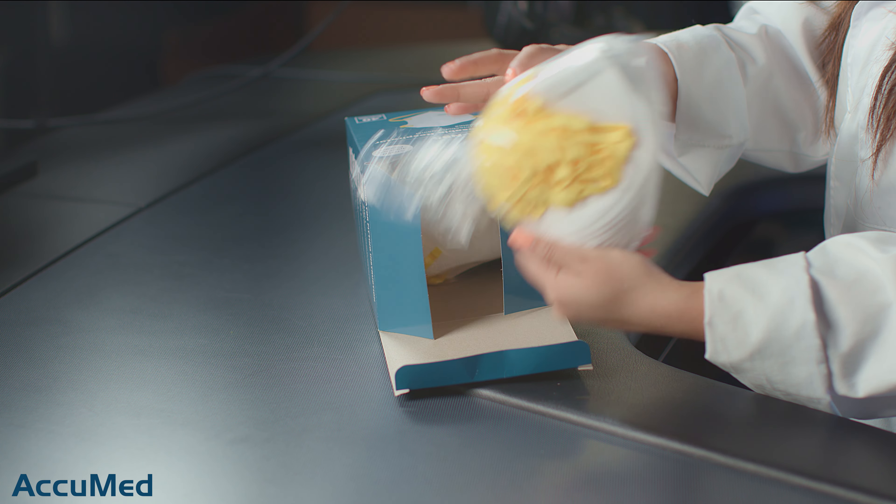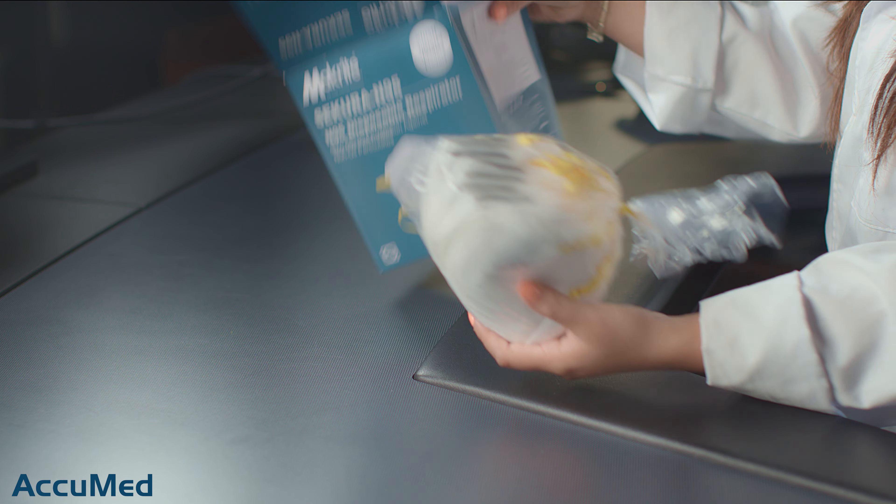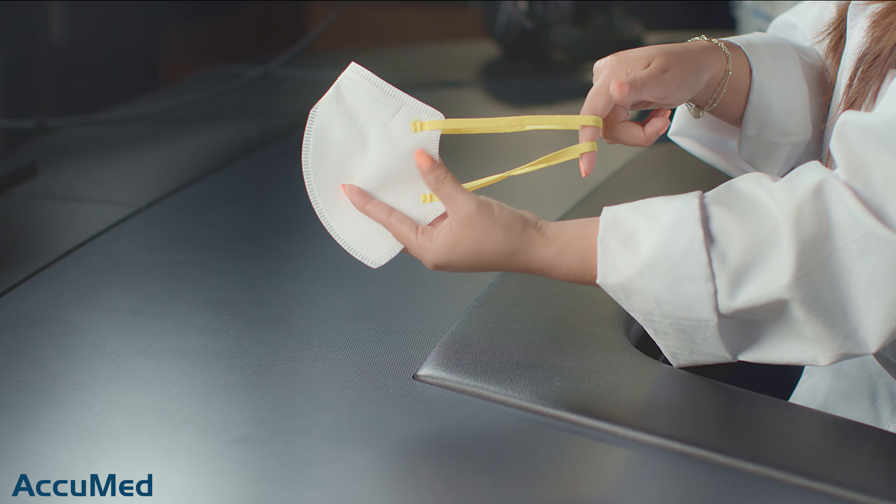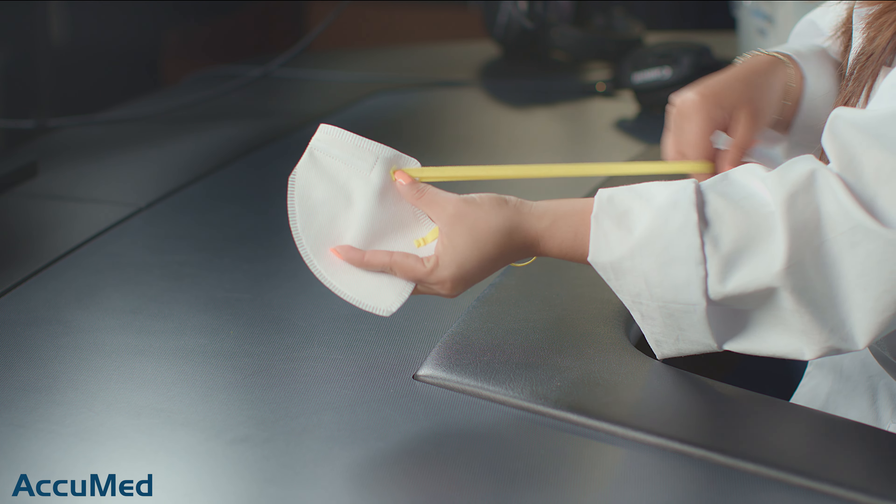Now let's go ahead and take a look at these respirators. They come in two bags, so I'm guessing each bag has 20 — very thin. They also come with the ribbed headband straps, which personally are not my favorite. These tend to be more uncomfortable to wear, so I'm going to see how this fits on my face.